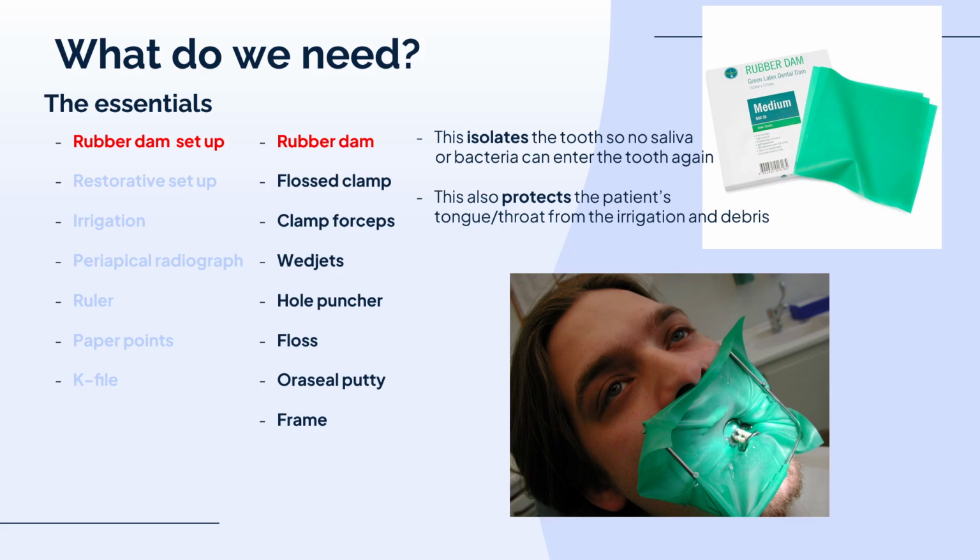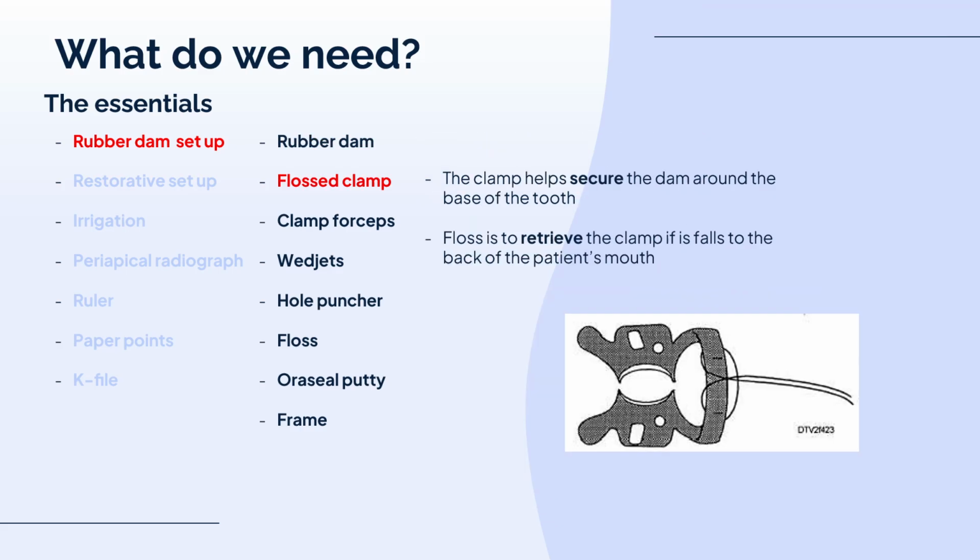So when we get to K files or rotary files, I'll show you, they're quite sharp, and there have been incidences where, obviously not with me, incidences where patients swallow these files, they get stuck in the lung, and it's a nice lawsuit for you to deal with.